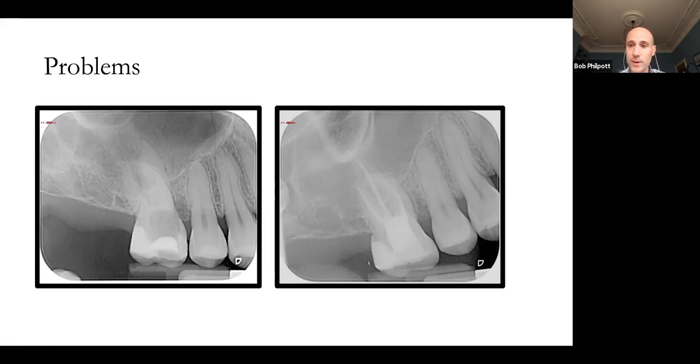The person doing it didn't set out to do it. And you can see it's completely an orientation issue, because you can see the pulp chamber radiolucency behind the access cavity. So all that has happened is, depth-wise, it's actually not bad. It's away from the furcation area, but the orientation's not right. It's just gone off angle. And sometimes that happens. It's very similar to the image I put up on the cover slide when I started, where you've got the right shape, you've got the right depth, but you're just not in the right position. And that can happen sometimes.